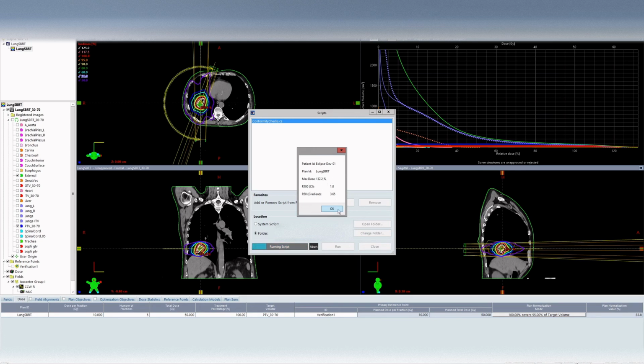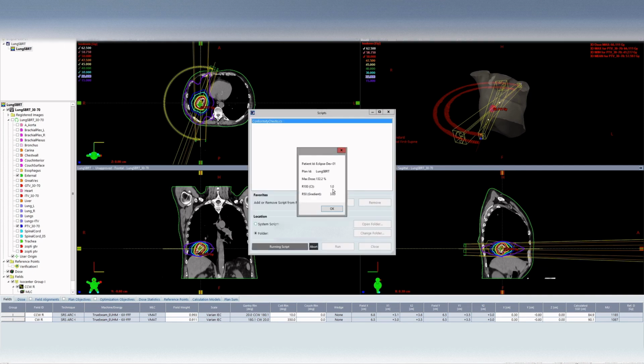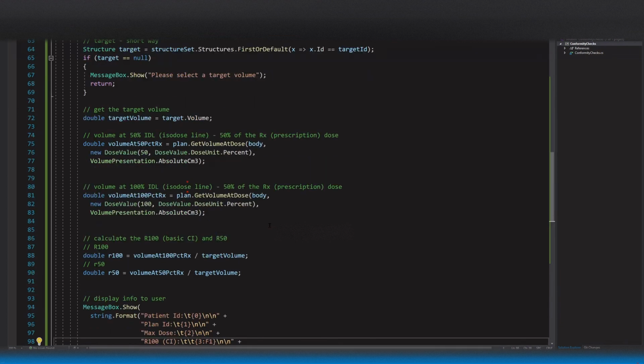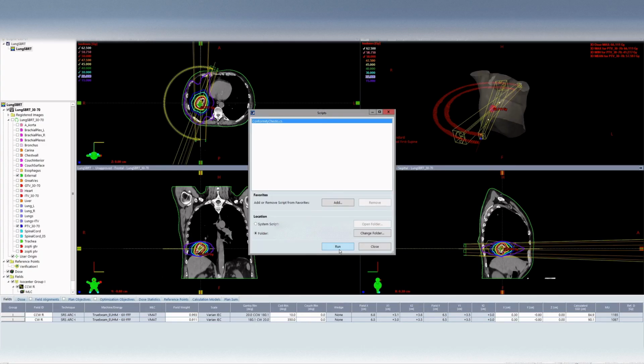And you know, we could actually change this to absolute dose, and let's see what the difference is now. Oh, actually it still did it in percentage. That's interesting. I guess we would need to set the plan's dose unit. I think we could set it to absolute. So like if we did plan.DoseValuePresentation equals DoseValuePresentation.Absolute. So now if we ran it, we would get it in gray. So that's how you would change that.